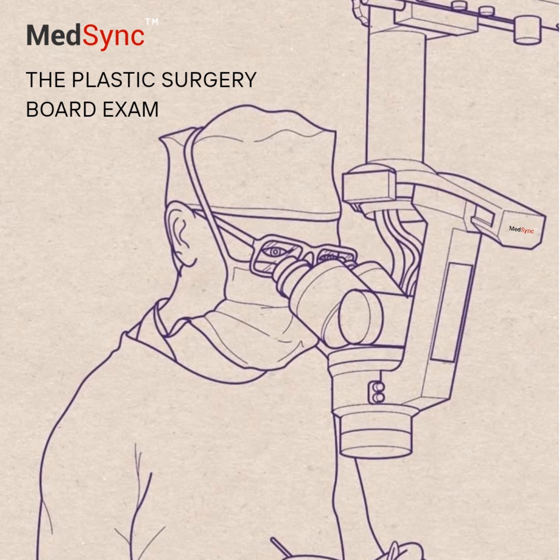Got it. Okay, let's shift to the clinical side. What are the crucial laser properties we need to understand for applying them? Wavelength is absolutely number one. It dictates how deep the laser penetrates the tissue. And longer wavelengths penetrate deeper, generally? Generally, yes. Within that sort of therapeutic window of 400 to 1400 nanometers, deeper penetration. It relates to the tissue's absorption length for that wavelength. And spot size matters, too. A larger spot size can help achieve the maximum absorption for that wavelength and can also increase the depth of penetration slightly due to scattering effects.